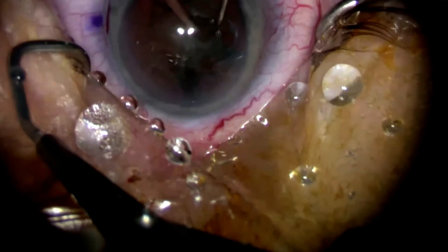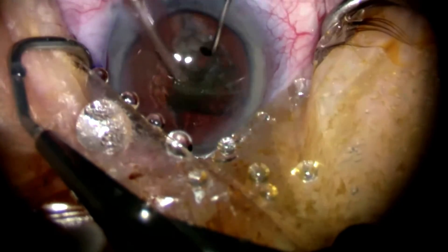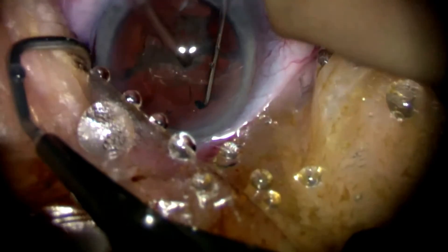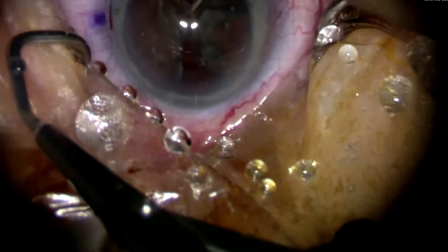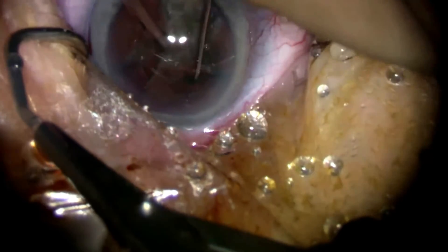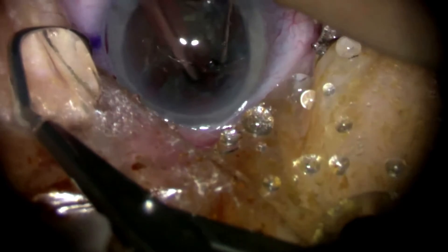You can see that we'll get good purchase on the lens with 400 or 450 millimeters of mercury vacuum. This is about a 3 plus nuclear sclerotic cataract, although in general I do like to do all of the chopping in situ as this stabilizes the bag and makes the pieces easier to manipulate. With horizontal chopping you don't need to stabilize the nucleus as much with the vacuum because you can trap it between the two instruments. Once you have good purchase you can use the chopper to separate the two pieces after pushing it down into the lens substance. We'll rotate the large remaining piece around, get good purchase, do a little diagonal chopping motion, and you can see how effectively this disassembles the dense lens. We'll get good purchase on the last piece — about 400 millimeters of mercury — then use the chopper again to split it, giving us about five or six pieces ready for removal.